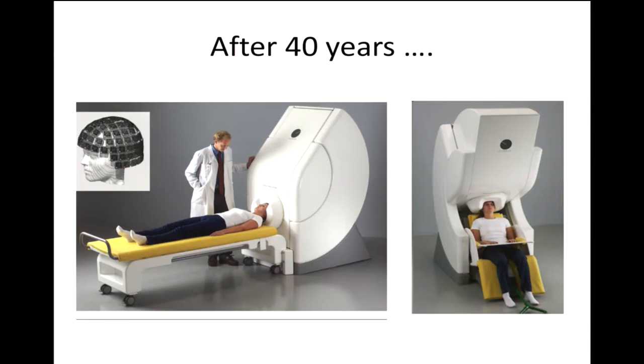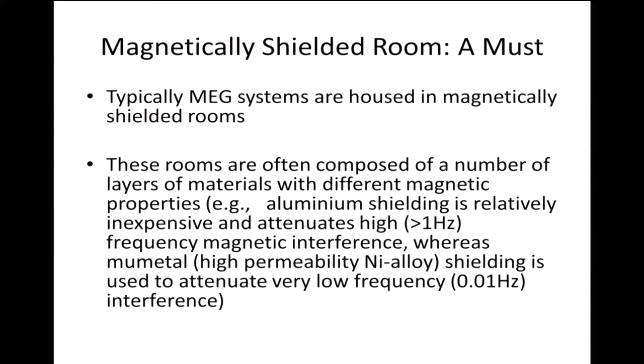And another very important thing: you cannot move, or you're not supposed to move. Any tiny movement, any micro movement, would distort your signal quite significantly. So literally you have to sit, stand, or lie down very, very still.